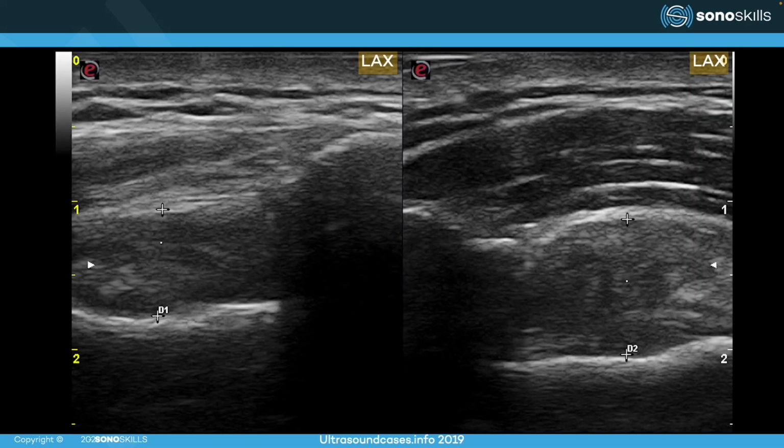Also at this level near the acromion, you can see that the left side is the healthy side, the right side is the affected side, and you will see that this supraspinatus is higher, thicker than the height of the acromion. So it's going over the acromion almost. So this distance does not fit into this subacromial space, leading, of course, also to an impingement. This one does definitely fit underneath the acromion, and this one doesn't.